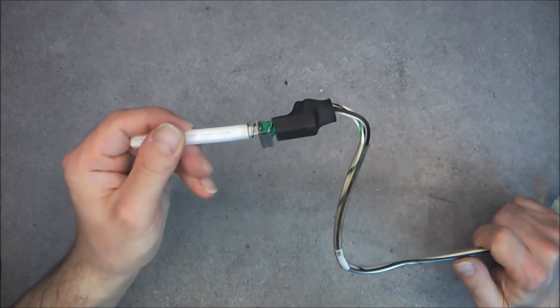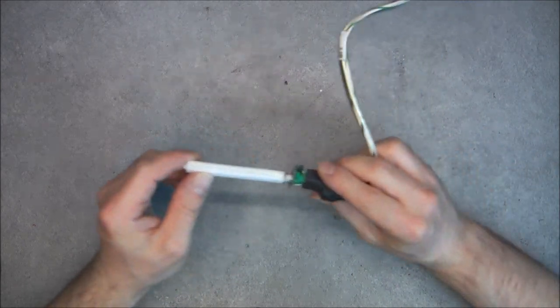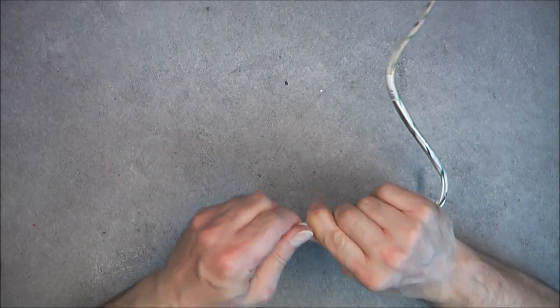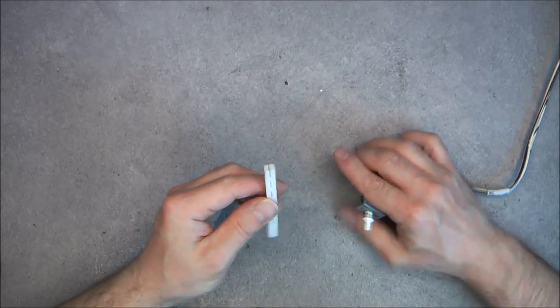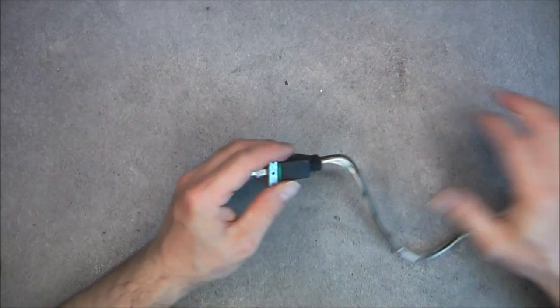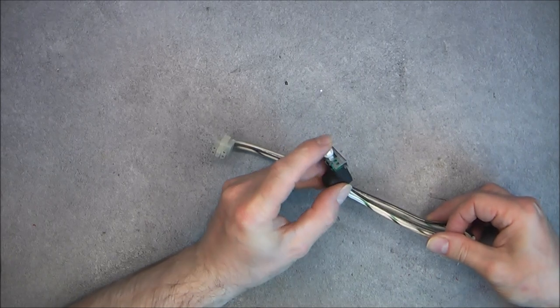Here the main switch, which was stuck because of the front panel out of alignment. You can see they did use a regular switch with prolongators or extenders, whatever you want to call them, which are actually pretty hard to unclip. The first one is broken, but this thing might be handy, so I will keep them. About this switch, I am not sure. It must be quite worn out. Anyways, okay, one thing out of the way.